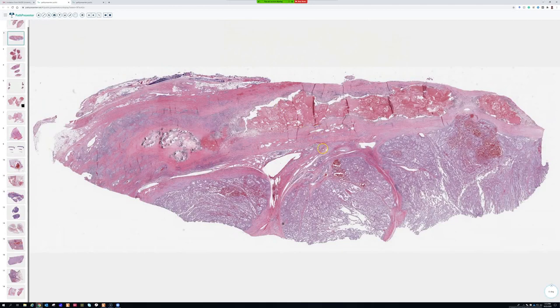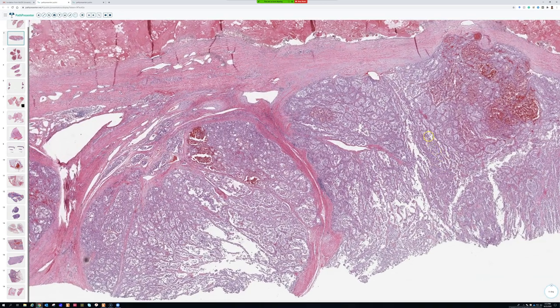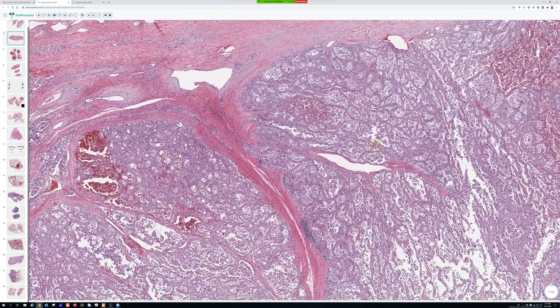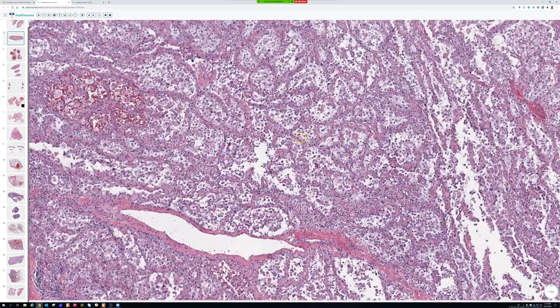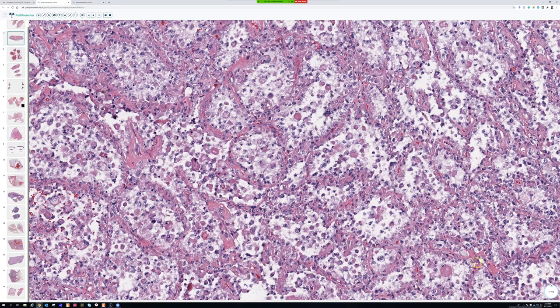Switching gears — here's a piece of a tumor, a big deep soft tissue mass. Anyone want to take a stab at what this might be? That's a good differential. Anyone else can chime in if you have different ideas.